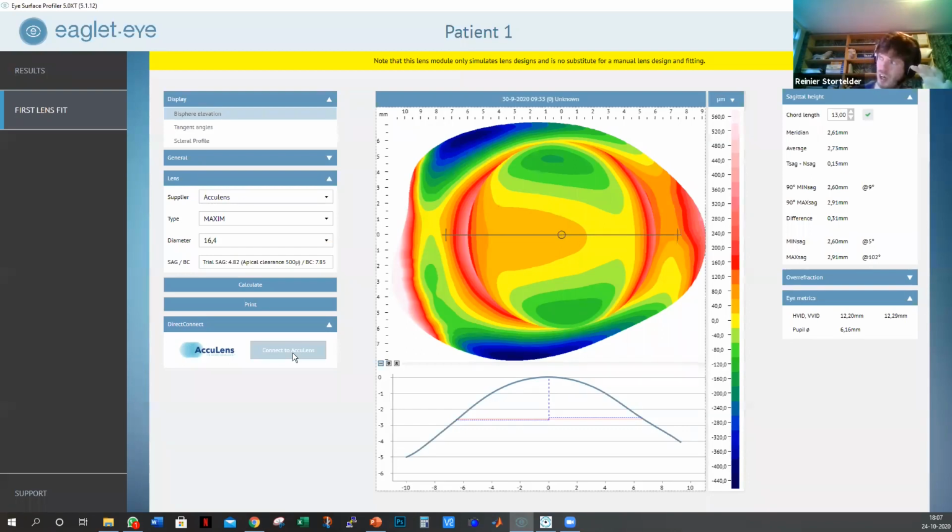At that moment, you push all the information to Troy Miller, and it's probably not a scan fit, but he's doing a very nice job with a very customized lens based on 8 meridians off the top of my mind. So he's creating a fully customized lens. It helps him with centering, decentering the lens. Yeah, you still have to pop that lens with all the marks on eye, but it really helps him to design the lens centering as good as possible.